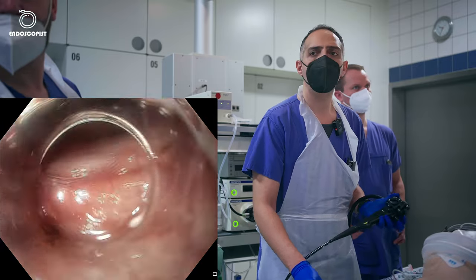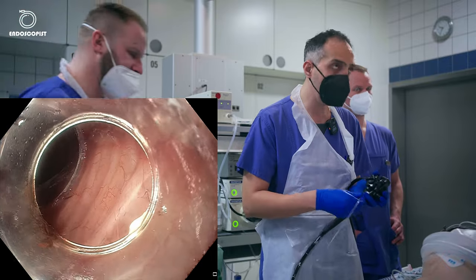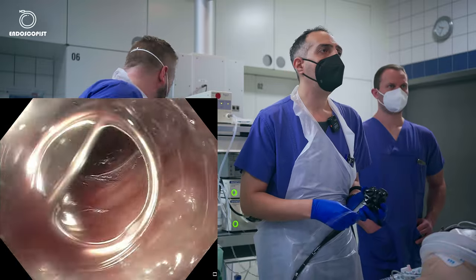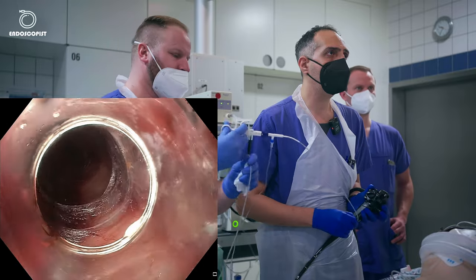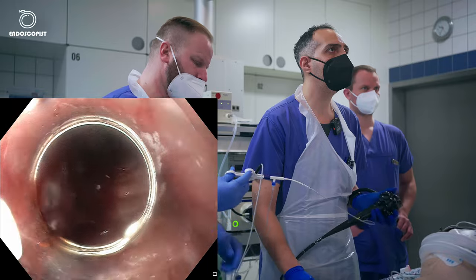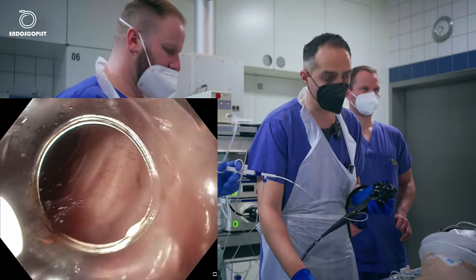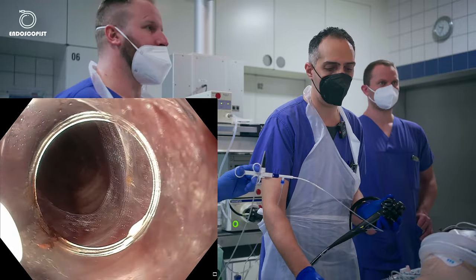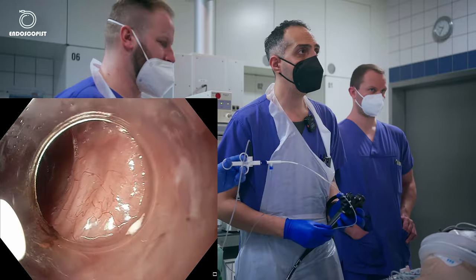Okay. So with the tunnel, we'll start 5 centimeters below our incision. Okay. I will use spray coagulation to do the myotomy. So our tunnel is here. This is 25 centimeters, no, about 30. So I will start like here, 5 centimeters below the incision.